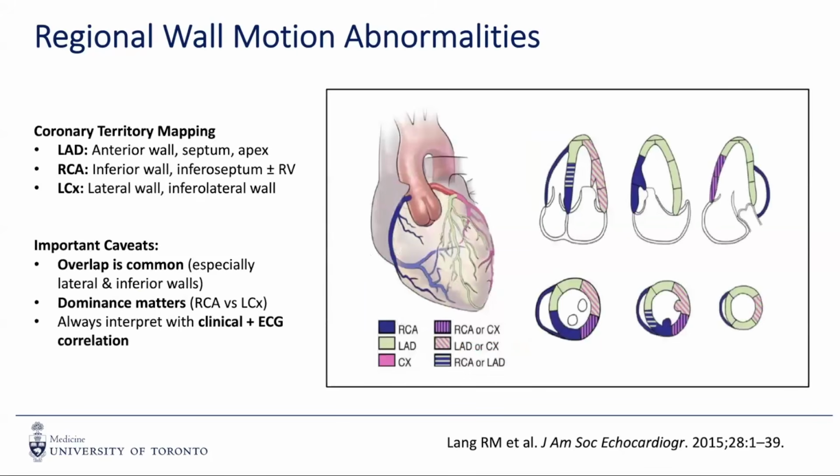And we're also able to map it out into coronary territories to tell us how different walls are doing. And with that information, especially early on, even in the emergency room, we're able to have a guess of which artery could be involved. And this is definitely helpful when planning for interventions and planning for cath as well.